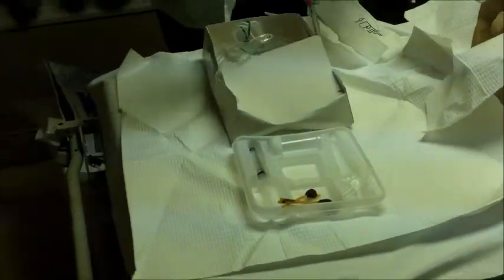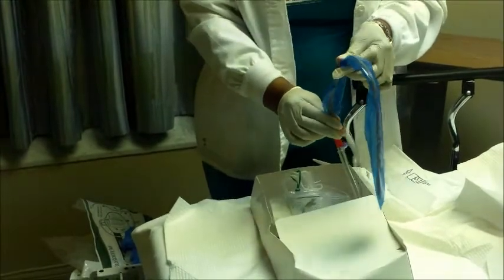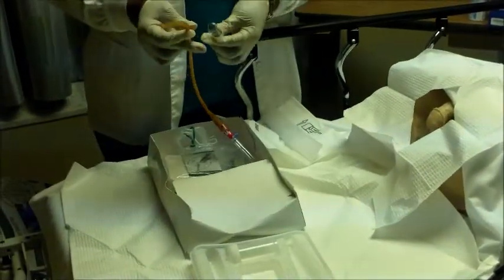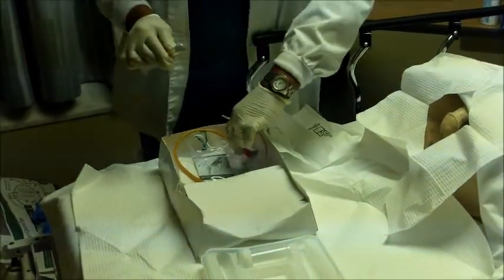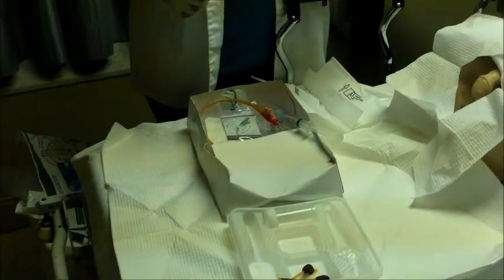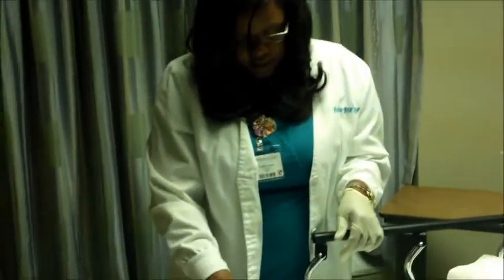Okay. Now, with the Foley catheter, you want to make sure that you're careful with the tubing. It is real flexible, so I want to make sure that I do not contaminate my catheter. I want to attach my 10 cc of water to the tube, and there's no need to blow it up to inflate it to see if the tubing is good or not.